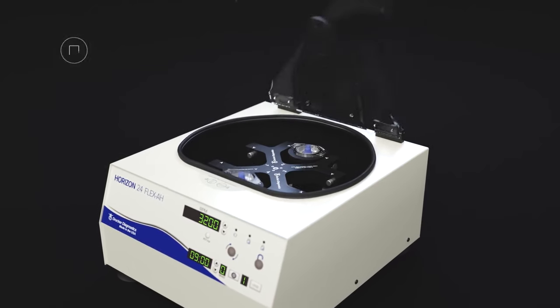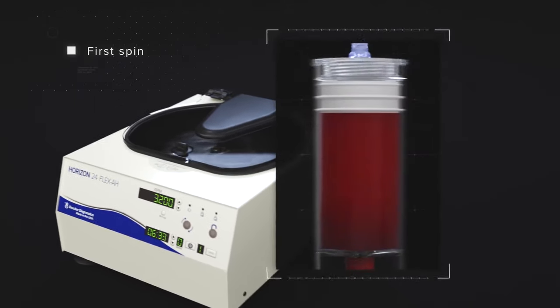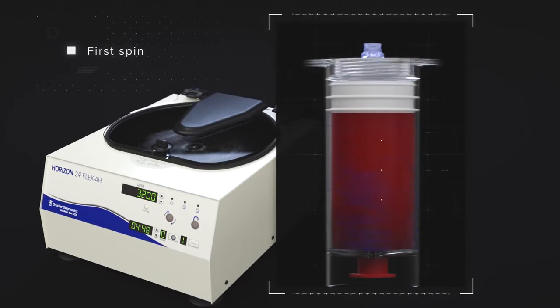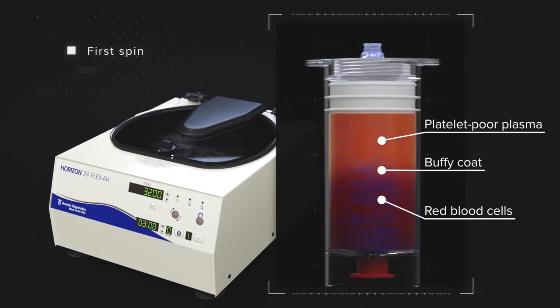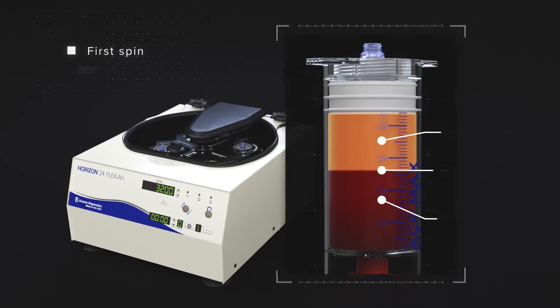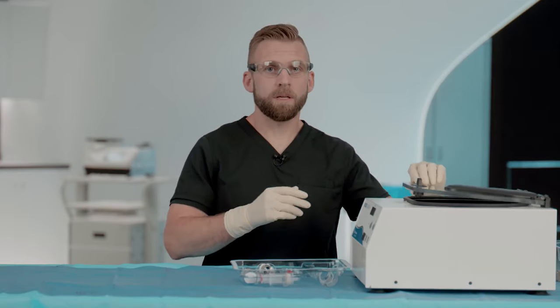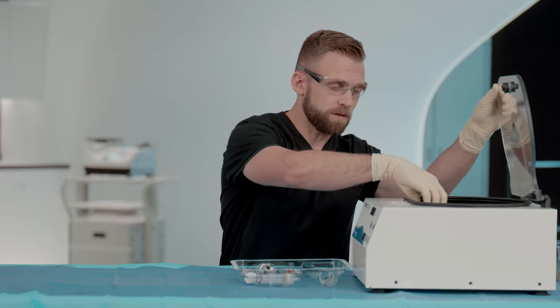In this first spin, we're separating out the platelet-poor plasma and creating a buffy coat layer. The platelet-poor plasma rises to the top of the density gradient, while the buffy coat is concentrated between the plasma and red blood cell layers. At this point, we're ready to remove the PPP layer and extract the buffy coat.